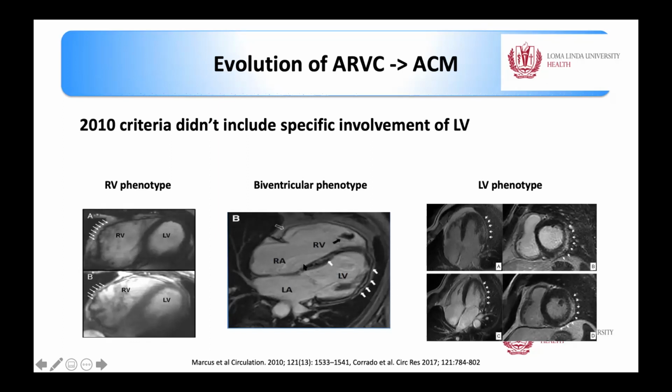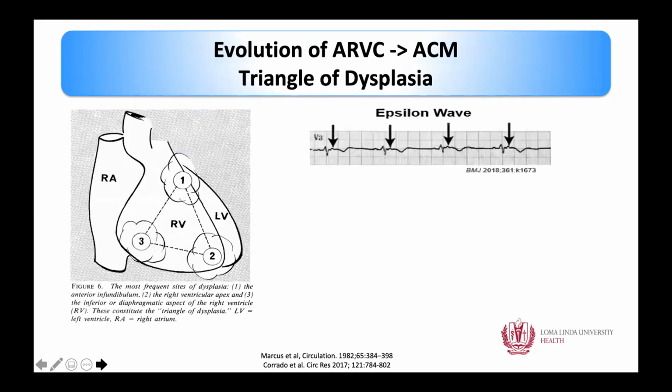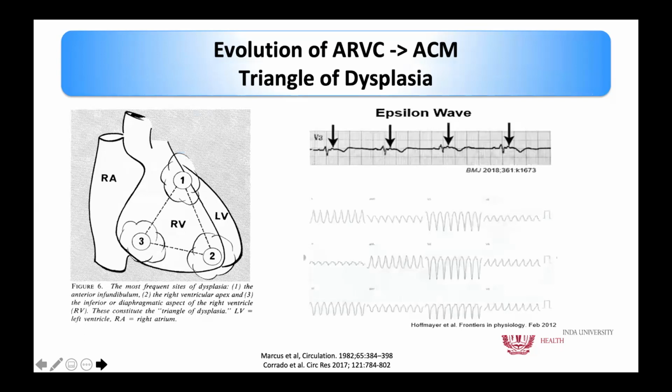So this patient met the criteria with RV, but you also can see this linear delayed enhancement in the LV. And this is a patient with biventricular phenotype. The serration on the MRI, particularly in this area, has been associated with arrhythmogenic right ventricular dysplasia. So keep that in mind. Just wanted to show you this triangle of dysplasia that is responsible.